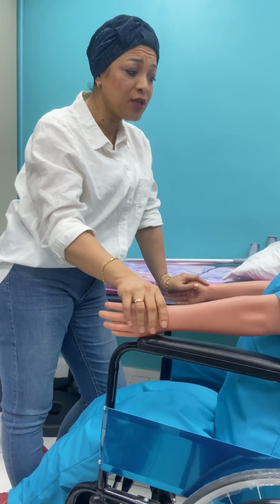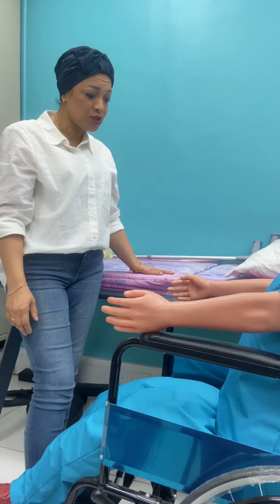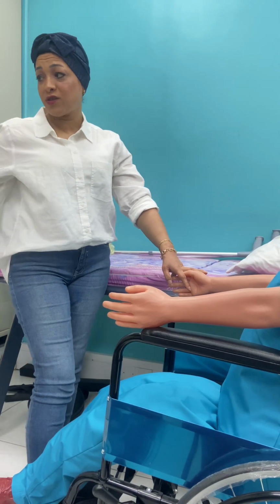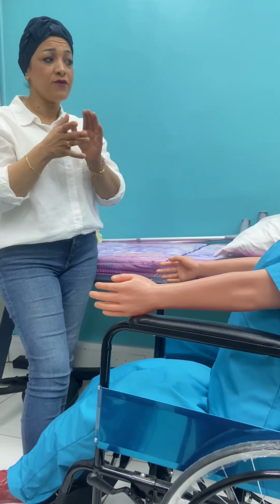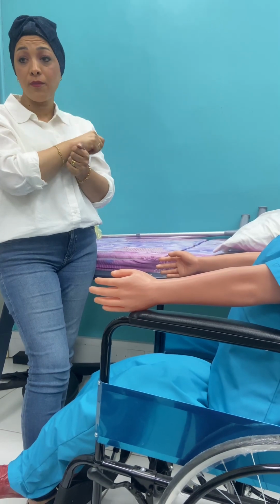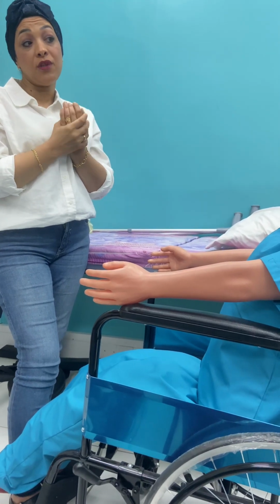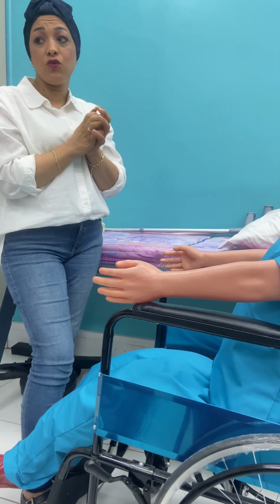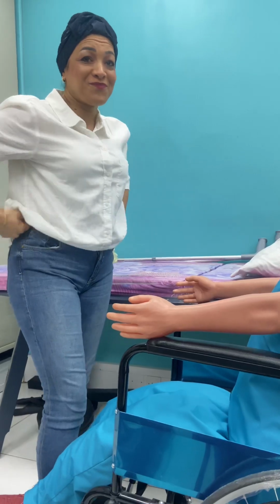Okay, so we explain to him it's good also for him to move, not to spend the whole day sleeping on the bed. We cover him. We ask him to stay on the chair, of course safely. If there are relatives, they'll be around. I go remove my gloves, wash my hands, and I have to document that I transferred the patient from bed to chair safely without any incidents. If it happens that the patient falls from your arms, anything, you have to note it so that they can do the right investigation later. Okay? So this is step 1.